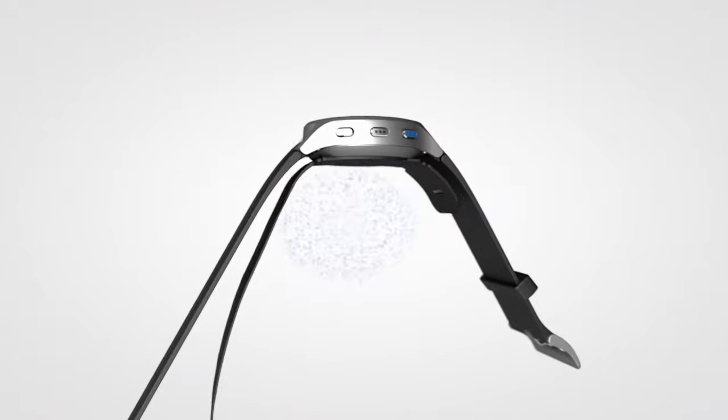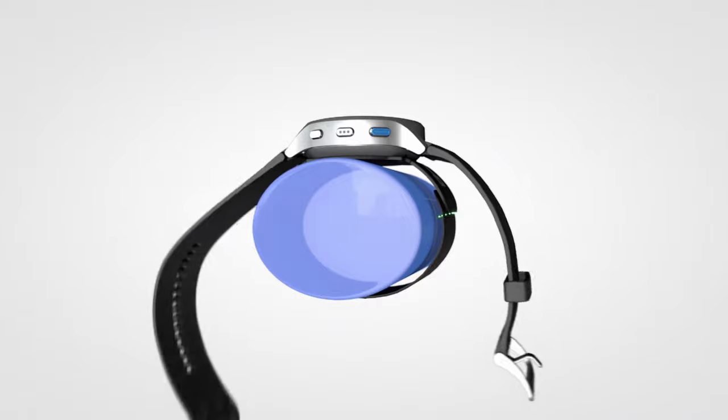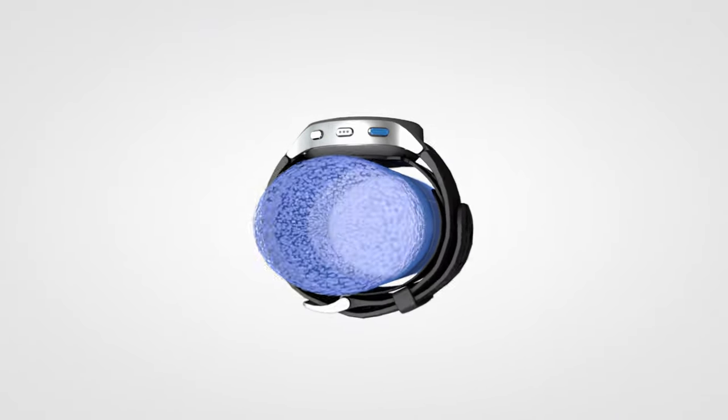Step 3: Ensure the watch's inner cuff is positioned correctly. If the upper and lower sides of the cuff are overlapped, the lower side should be positioned underneath.